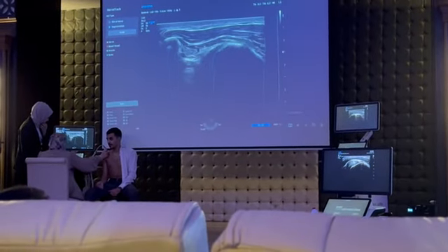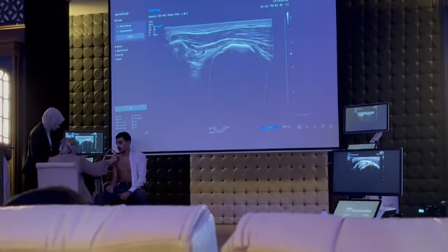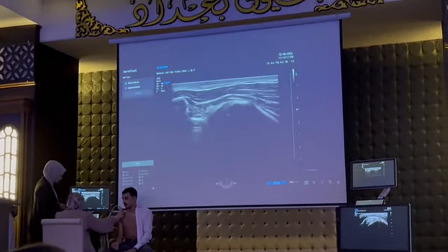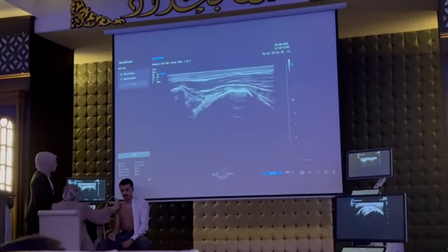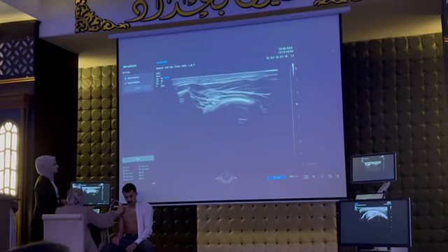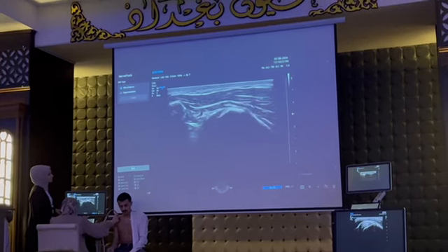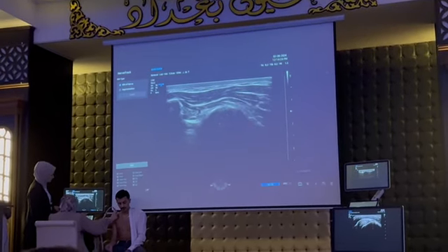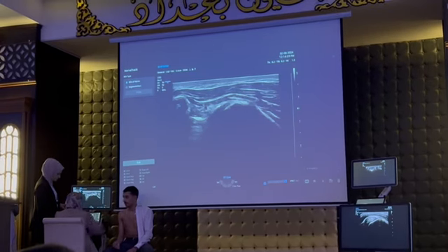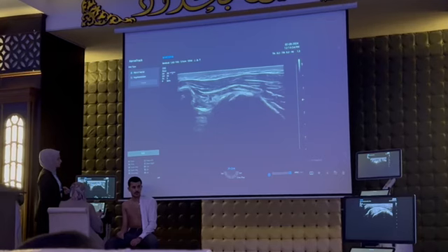This nerve that appears on the... so you see this yellow rectangle or yellow box appear on the nerve. Appear and go, appear and go. This is the lateral pectoral nerve, which lies just above the medial part of the coracoclavicular ligament, the conoid part.